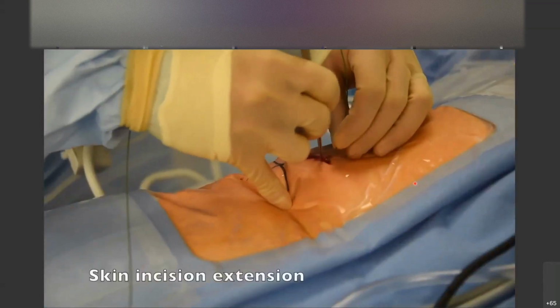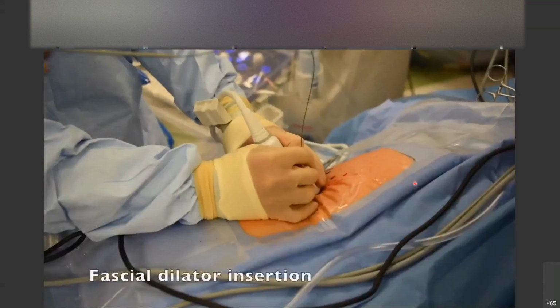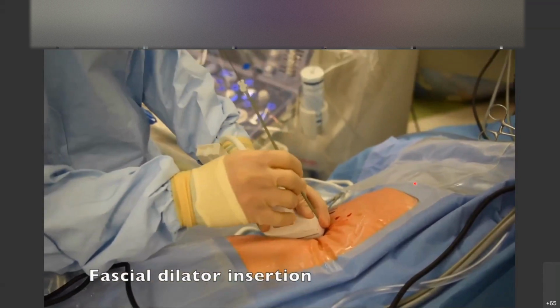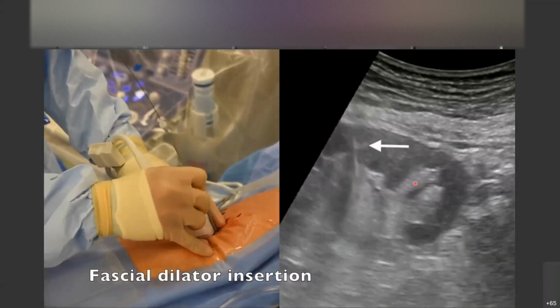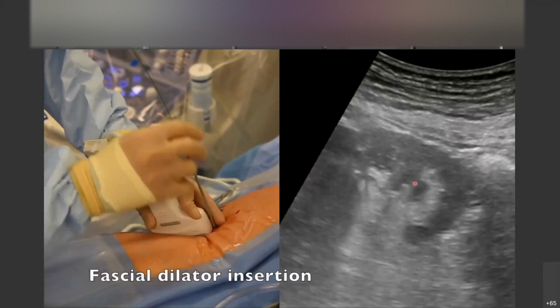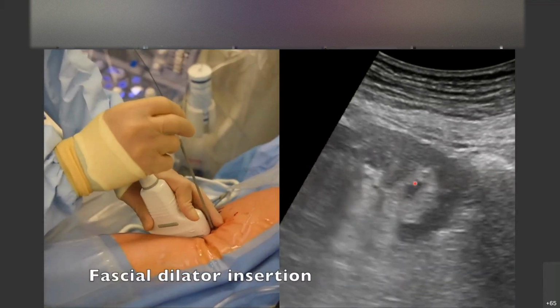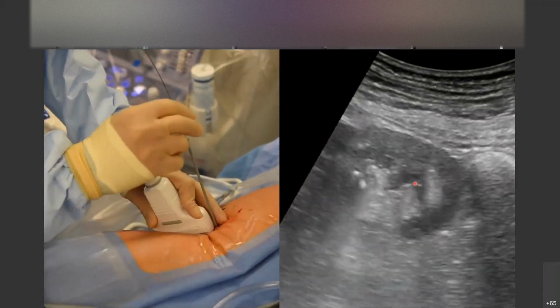Make a little incision. You can pass your dilator next so that you have the ability to place a safety wire if you want. Start with an 8 French fascial dilator and then move up to the 10 if you want to use a safety wire. At UCSF, we typically did not use safety wires during this part of the operation because since we're not going down the ureter, they tended to get looped around the balloons and actually made the access more difficult.